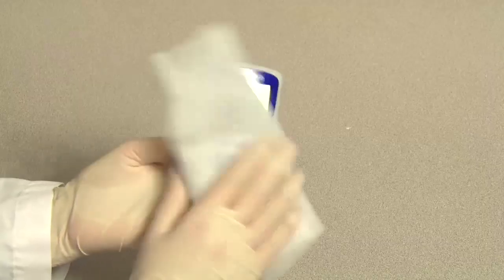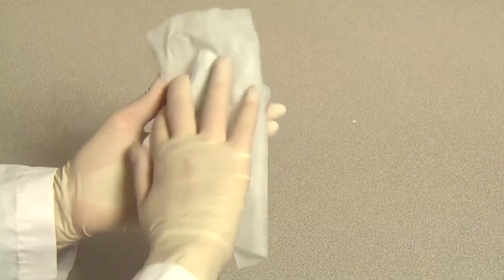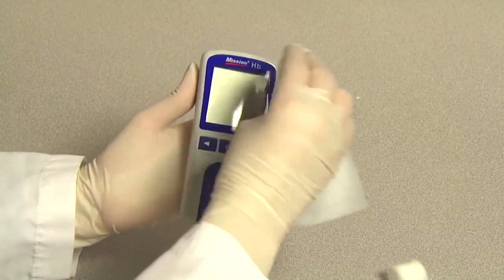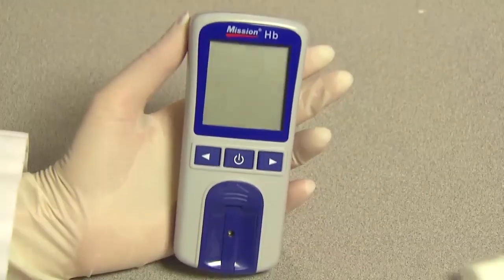For disinfection, please use EPA-registered wipes with active isopropyl alcohol to wipe the meter. Be sure to wet the entire meter surface thoroughly and remove any stains or debris. The meter surface must remain visibly wet for one full minute, and then allow the meter to air dry completely before using it again.